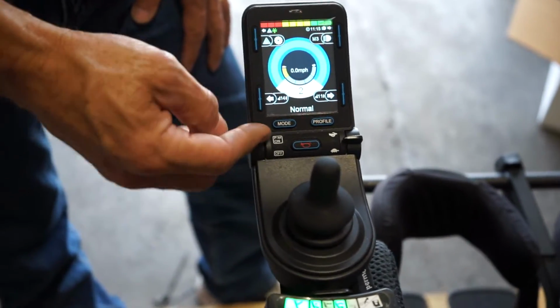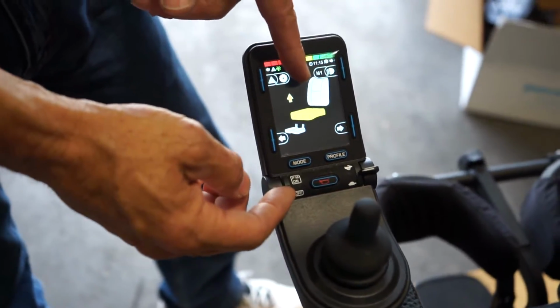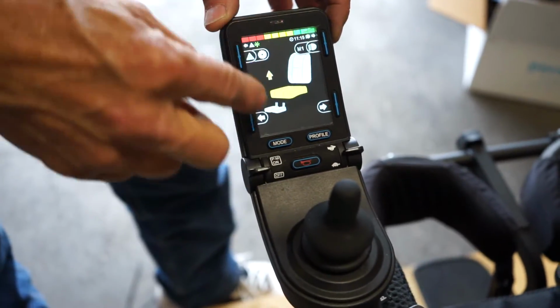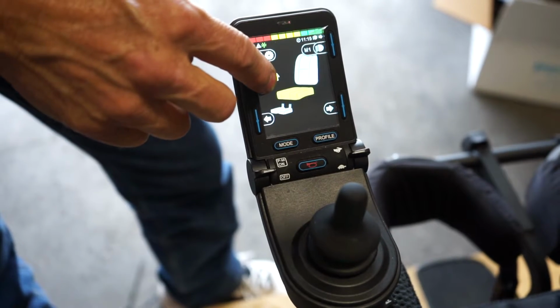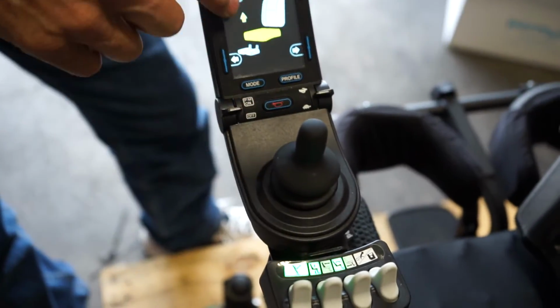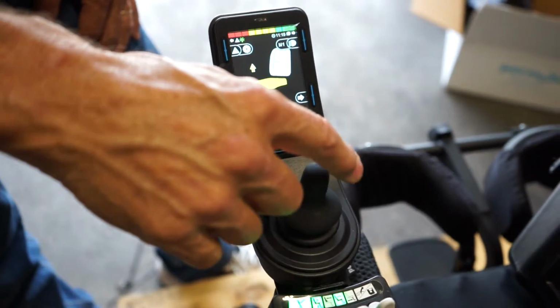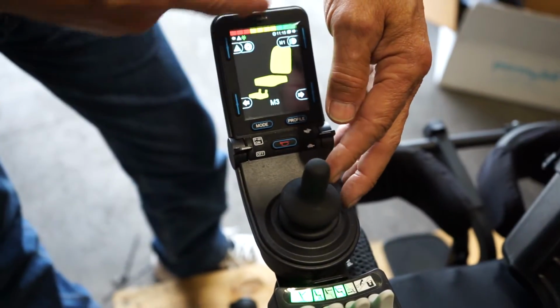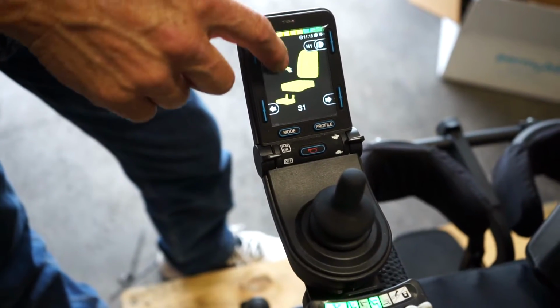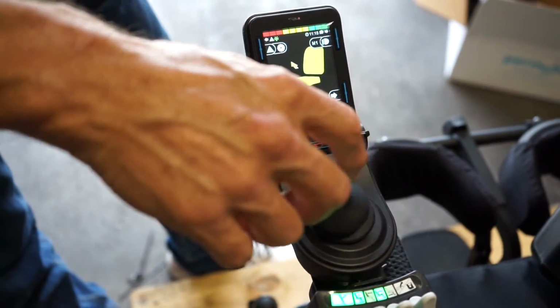If I keep going forward with the joystick, I'm going to go back to the seat, and again you move all the positions by moving the joystick, switching the colors, whatever color is on. Like right now it's only the seat. That would be the seat lift only, the second one right here. And if I keep moving it sideways, this is the complete tilt. This would be the standing position with the arrow like this. That means the whole seat's going to go up.